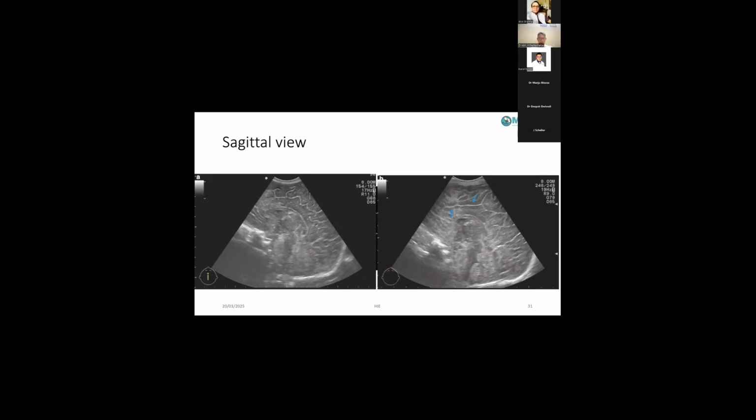The ventricles look slit-like in the other one. Yes. And again, as I said, it looks kind of hazy and fuzzy. The lines are not clearly demarcated if you pay close attention here. Whereas in this one, you can see a nice fourth ventricle. You can see clear markings, which you can't see over here. And yes, you're right, it's not exactly the ventricle over here, it's a cavum, but you can see that it's being squished.